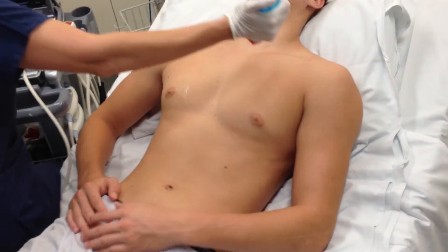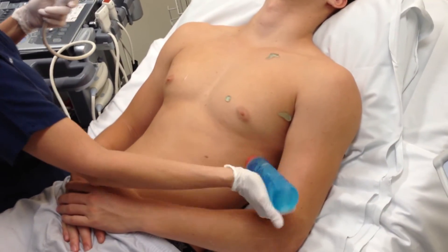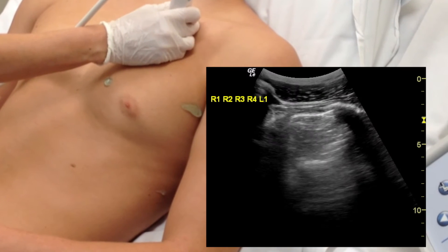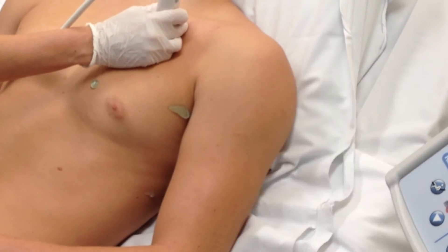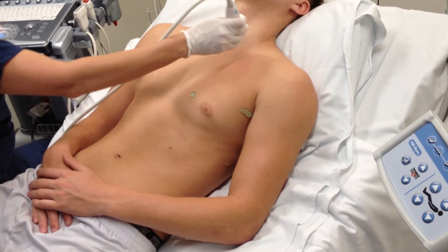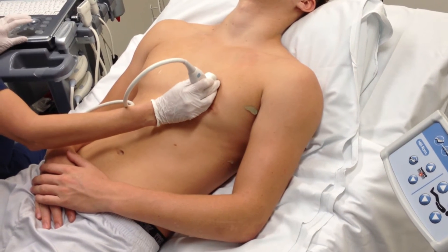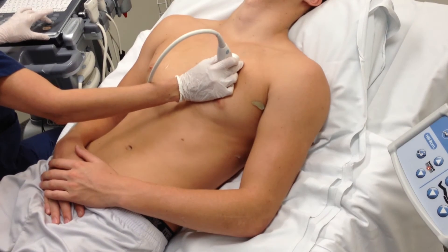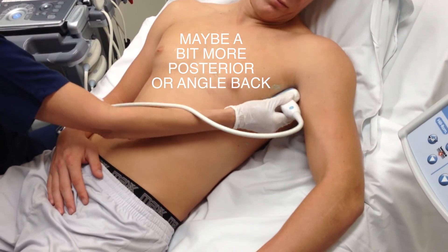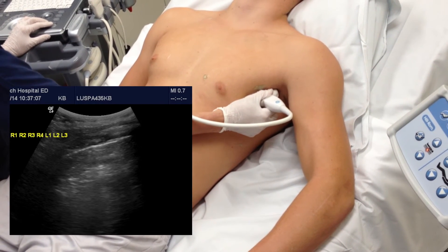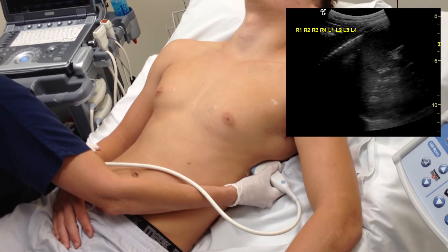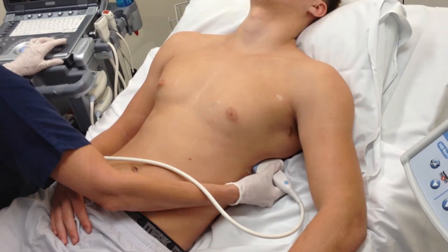Next we scan the left lung. The positions are all the same — Regions 1 and 2 in the midclavicular line, Regions 3 and 4 between the anterior and posterior axillary lines. Because you're leaning across the patient you may have to rock the probe a little bit towards the mediastinum. Again you've got clavicle on the left of your picture. Region 2 can be made a little difficult in patients with cardiomegaly — you may have to cheat a bit by moving more rostrally to get a picture of lung, and often you'll see a little bit of heart beating in the far right of your screen. Behind the anterior axillary fold, the last picture again has your hand flat on the bed to get that costophenic recess. Note in the picture how we have the lovely curtain sign of the lung obscuring the spleen.